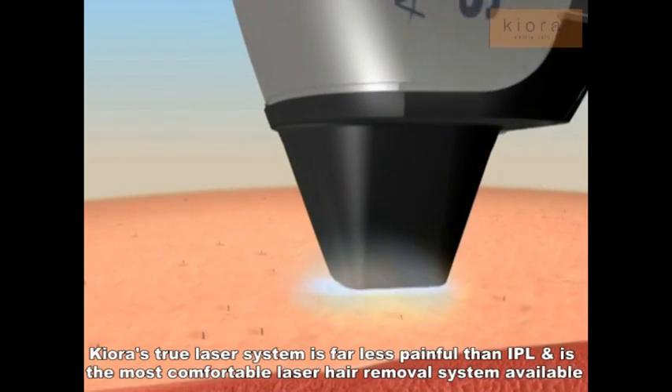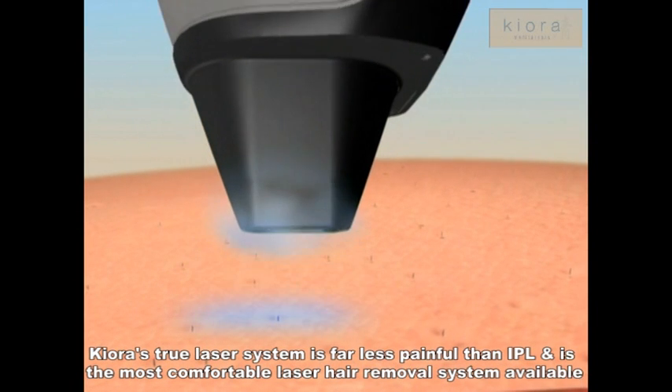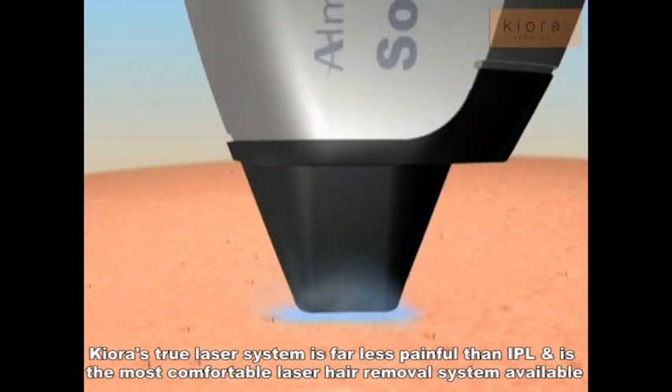The SHR mode protects the epidermis and provides a virtually painless treatment. The sapphire tip on the handpiece provides contact cooling to the epidermis, preventing superficial heat injury.